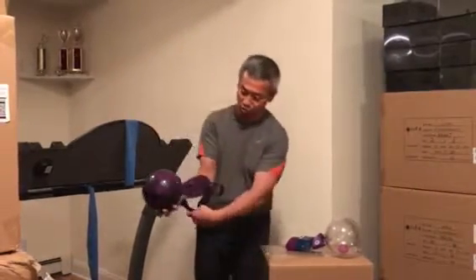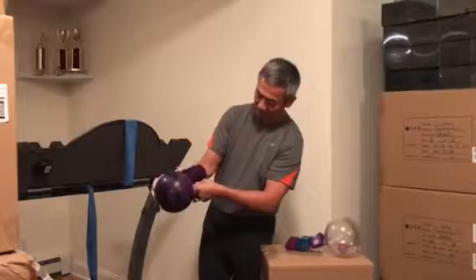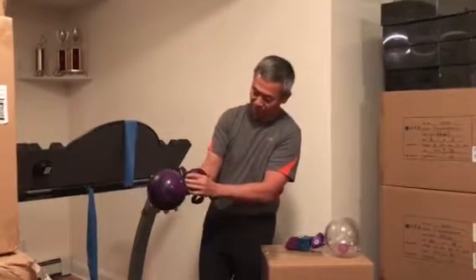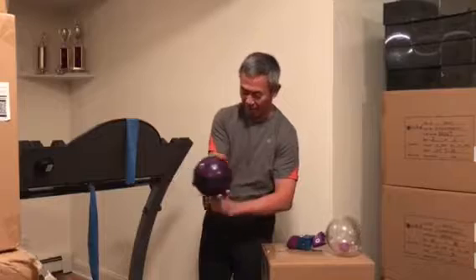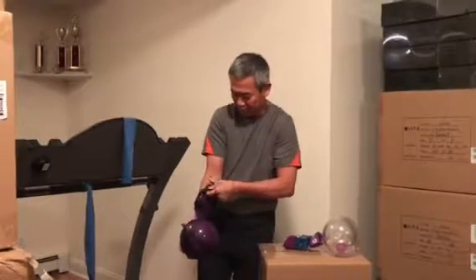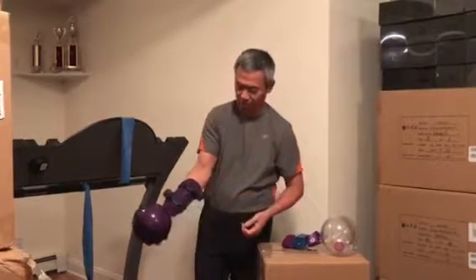And then you would pull on this rubber tubing and cinch it up, and it has these two knobs in there, and you can click it in there and you can slide it in like this. And for the other one, same thing. You want to make it as secure as possible, so this way it is securely attached to the wrist.